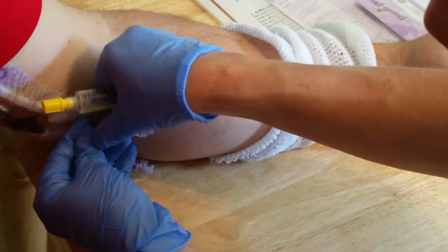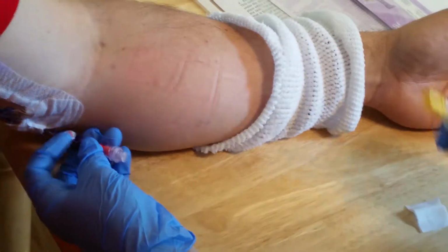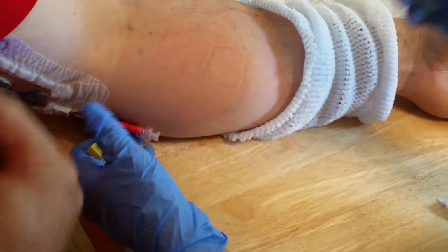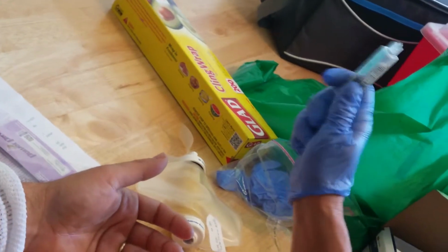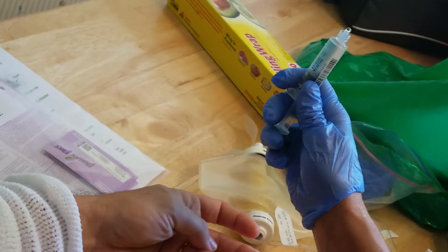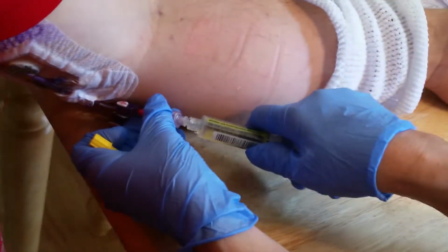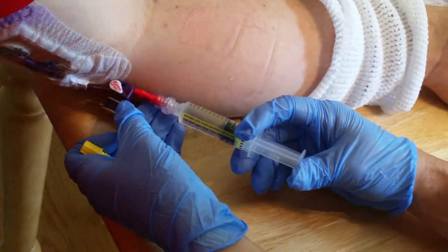Once a day probably is enough to flush. Now if that's clipped, it'll create pressure, right? What's that? Like if I forget to unclip that. The clip down here. You won't be able to get anything in it. But if we're alternating between the two, then each of them will be flushed once a day. Correct. Do we still need to do both each time, or just one? No. Once a day for this one, whichever one you don't use. Just maybe in the morning, flush it.